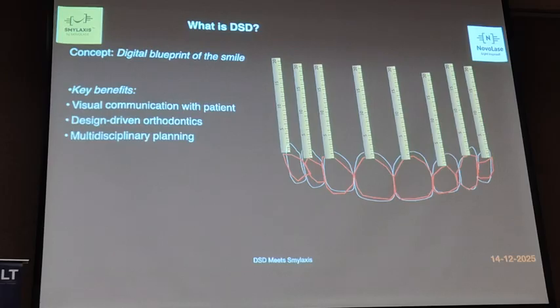With that, we prepare the scale. So what is the scale? It has red markings and white markings, right? Can you see that? The red lines indicate the patient's existing dentition, and the white line indicates how it should be, right? In aligners, we correct all these red lines.